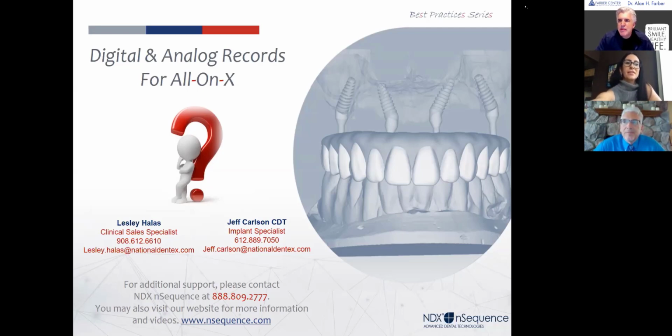We do have a hand up. Okay, Len? Yeah, hi, Jeff. I've been looking at a Planmeca 3D scanner to purchase. One of the selling points on that system is this anti-shake capability for persons, for children, anyone, to minimize the scatter and blurriness noise in the scans. That company is also advocating ultra low dose radiation, and they have some sort of complicated software that, with low radiation, but yet the same number of images, they're not compromising on the number of voxels, according to them. But the total radiation dose is lower.